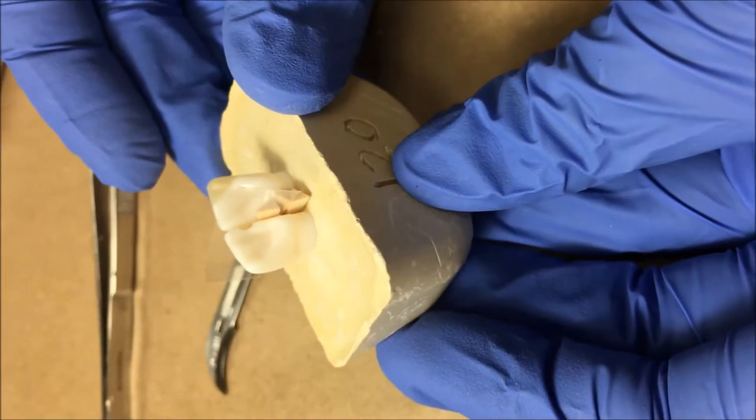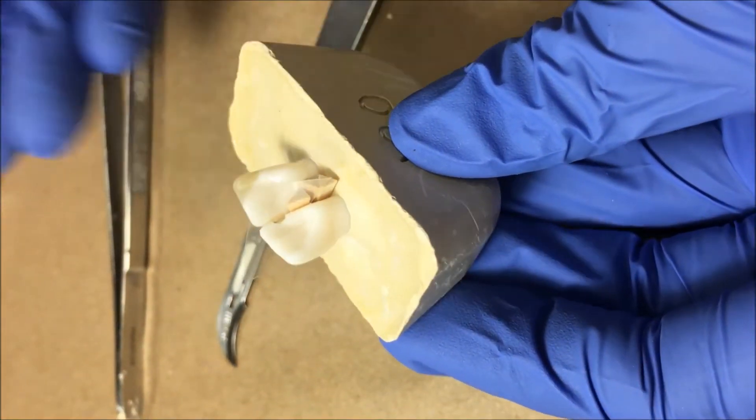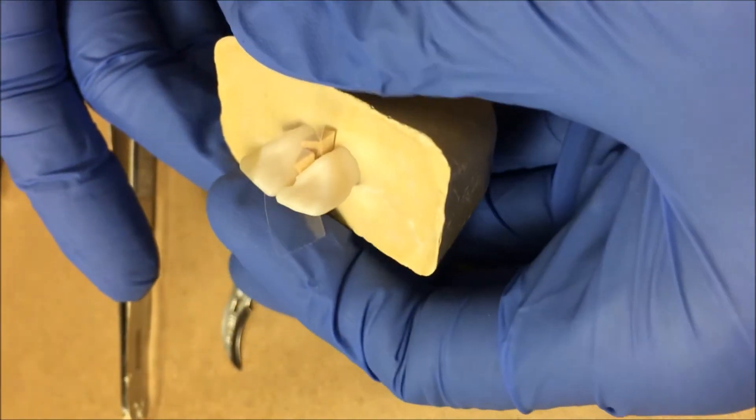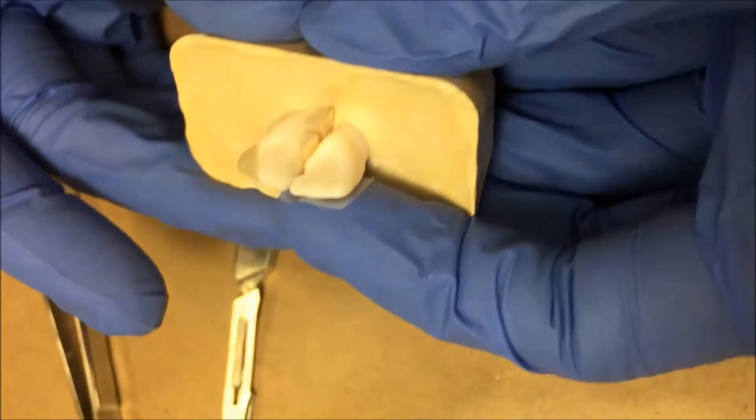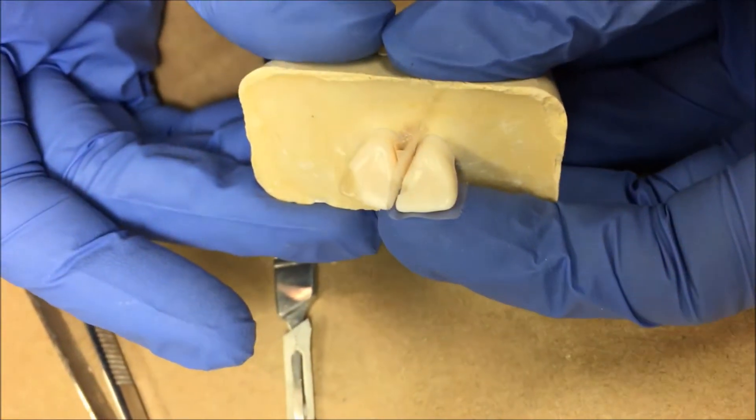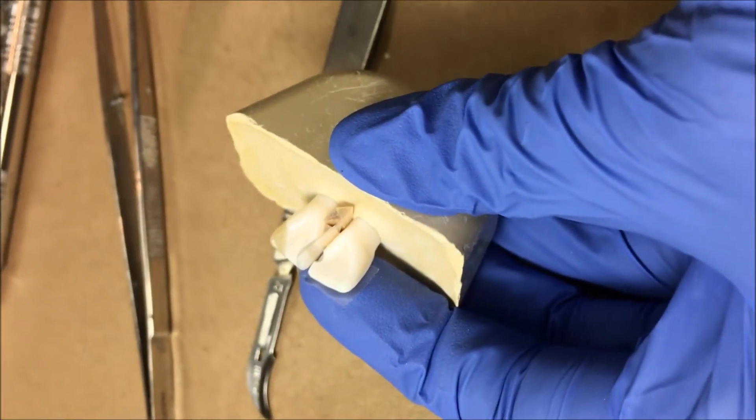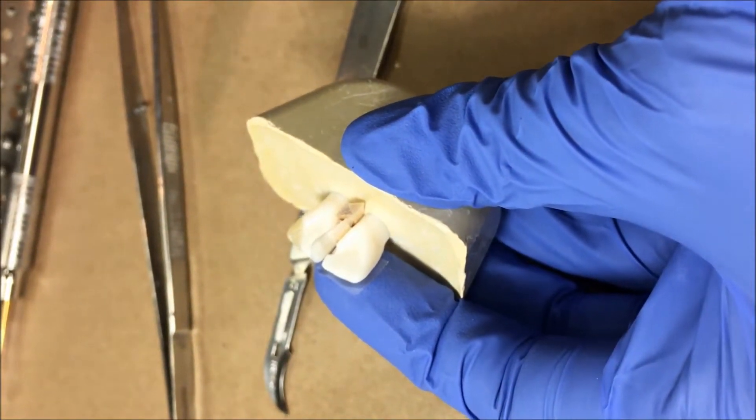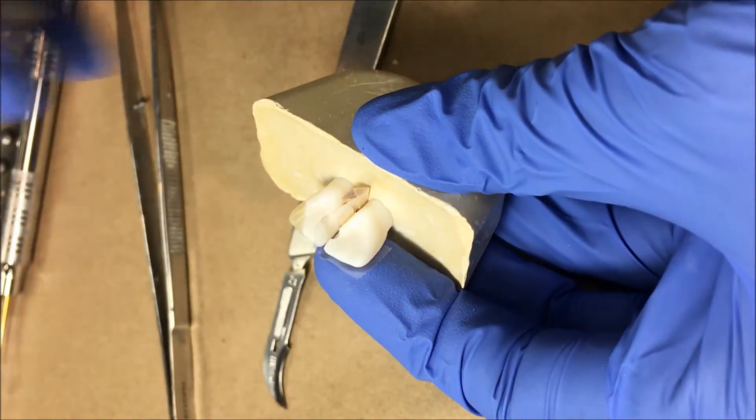Okay so I'm feeling pretty confident about the way those wedges are and that this is stable. So now I'm going to get to the point where I'm going to place my composite. When I do that because I have a lingual approach here I'm going to hold my finger against that facial with that matrix. What does that do? It prevents me when I put this composite in from just coming right straight out the facial.